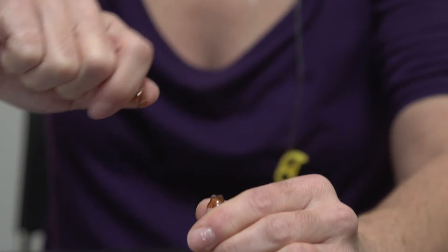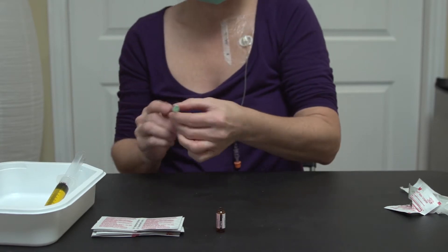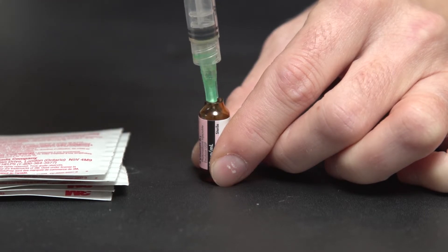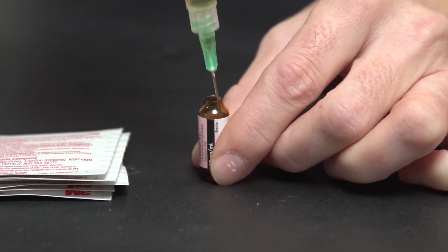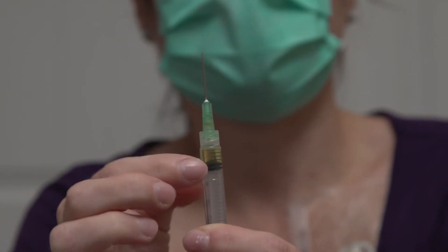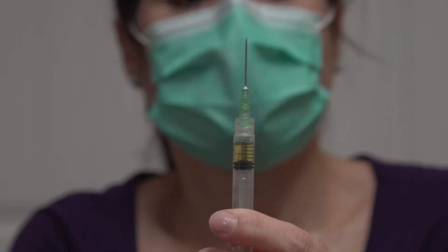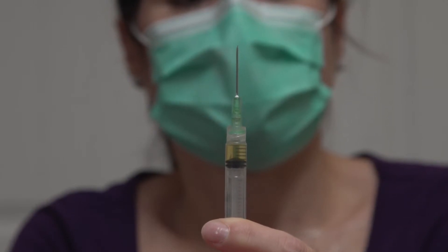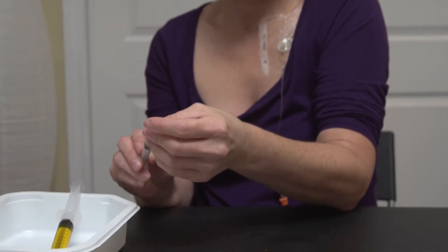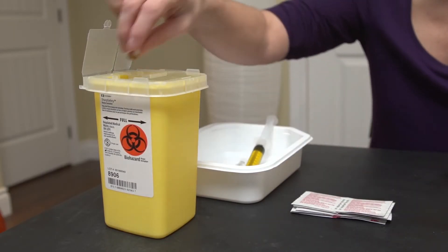Safely open the ampoule by firmly pressing away from you on the top section to cleanly snap the neck. You may use a sterile gauze to avoid cutting your hands. Hold the 3 milliliter syringe in one hand and pull its protective cap off with the other. Insert the needle into the center of the ampoule without touching the edge. Gently pull back the plunger to draw the contents of the ampoule. Evacuate the air from the syringe by gently tapping the barrel. Cap the needle without contaminating it and place the syringe in the tray until it needs to be used.